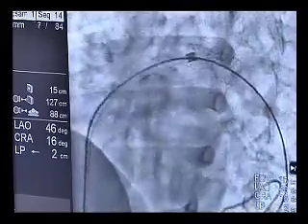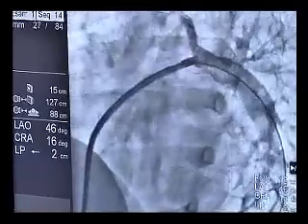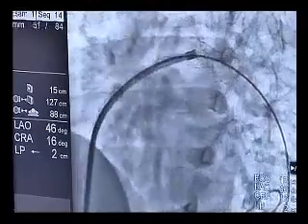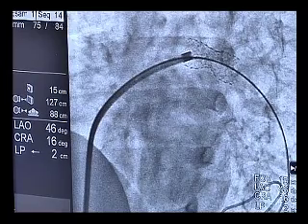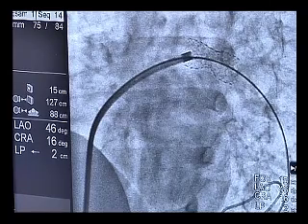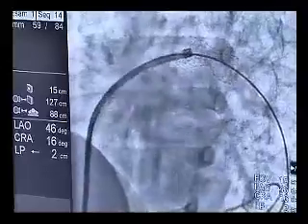On the native, it is our policy to pre-dilate with the cutting balloon, then with the high pressure balloon, and then with the stent if it's necessary. But after surgical, did you do that here or not? No, we didn't. With hindsight, do you think it would have been a good idea? I don't know exactly.